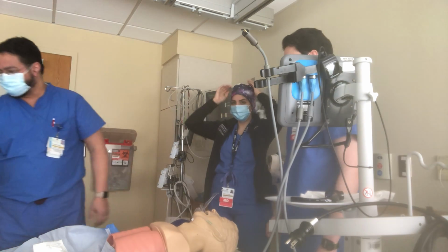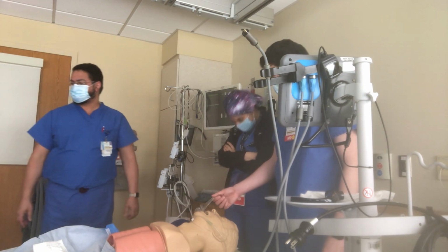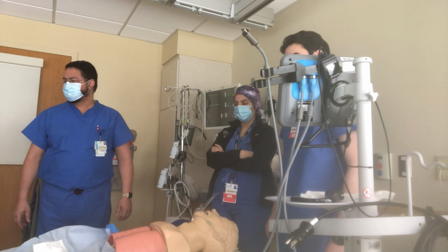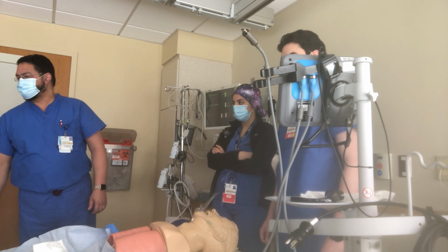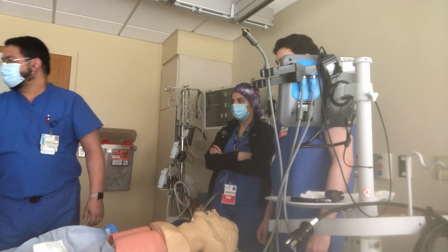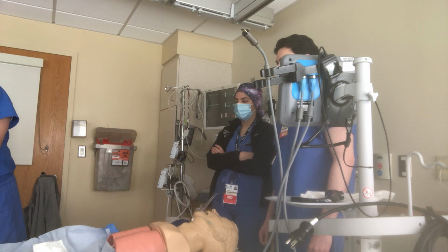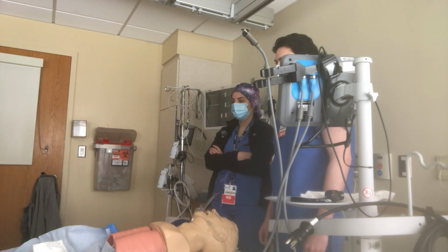How about the combi tube? And this is the last thing we're gonna talk about. I don't know where it is. Is that the one? That's the one. This? Yeah. All right. This is a combi tube, but we have one here. Can you see it? Yeah, right here. Perfect. This is the combi tube.